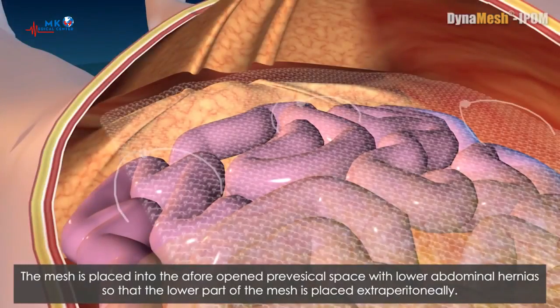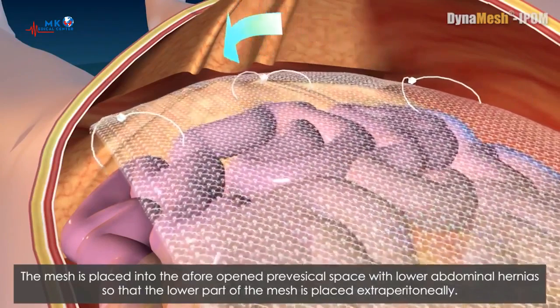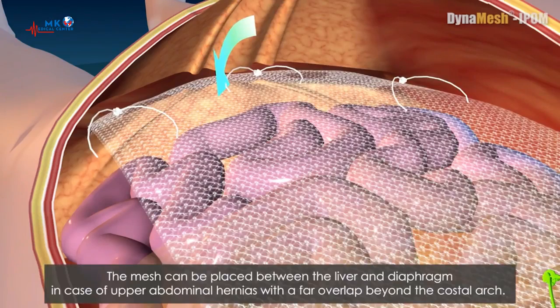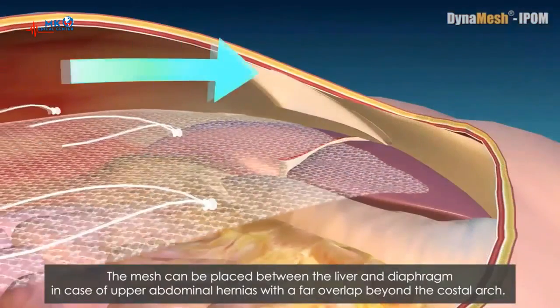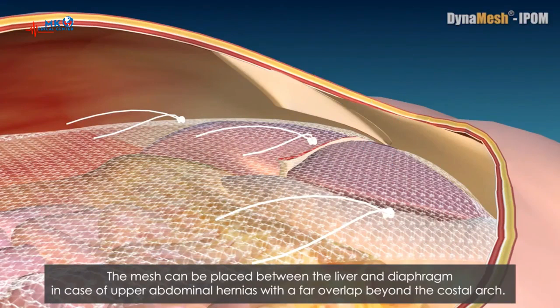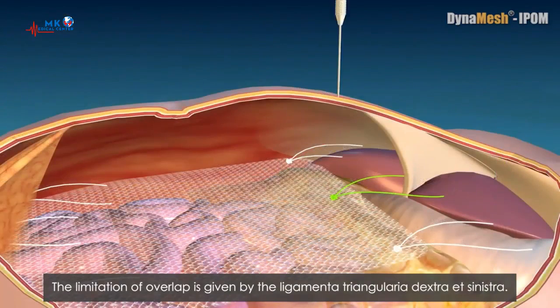The mesh is placed into the previously opened prevesical space with lower abdominal hernias so that the lower part of the mesh is placed extraperitoneally. The mesh can be placed between the liver and diaphragm in case of upper abdominal hernias with a far overlap beyond the costal arch. The limitation of overlap is given by the ligamenta triangularia dextra et sinistra.